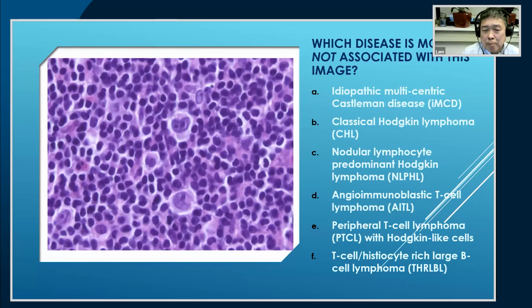Well, it has been debated by many what really is a Hodgkin cell, and I think Professor Toussaint will go into that a little bit more. And fortunately, nowadays we don't go by the criteria of it's a Hodgkin cell when 2 experienced pathologists call it a Hodgkin cell. These days we have many more techniques to establish our diagnosis than only morphology, and we will of course demonstrate in this webinar how to use them.